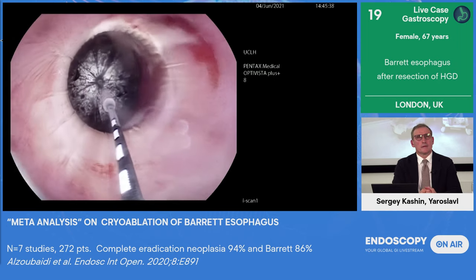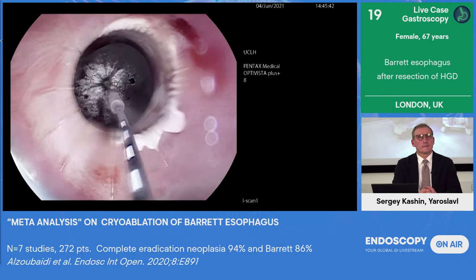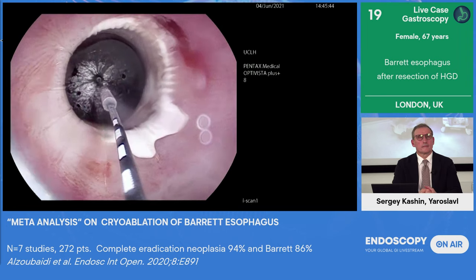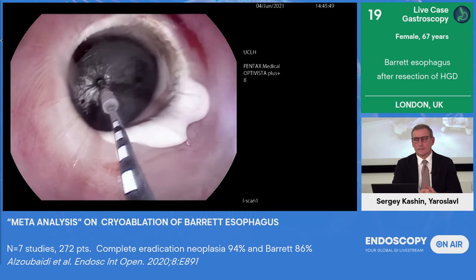So I'm just going to treat that here, and I'm going to treat that like this because I know the spray is dissipating away from me into that little crevice. And I know that I'm not over-treating here, and I'm getting really good coverage.